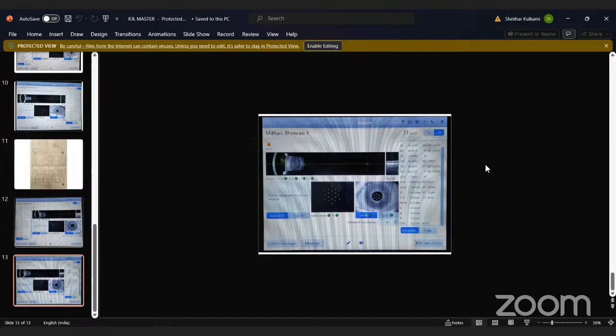Even if there is a dense cataract, like a dense PSC, where the center of the lens we can't interpret properly, even if the points are defocused and away from the optical density, the IOL master can calculate that excellently, and there shouldn't be any major difference between those measurements. So you can consider it even if we defocus it from the densest part of the lens.